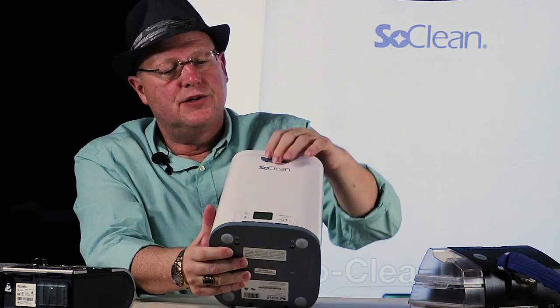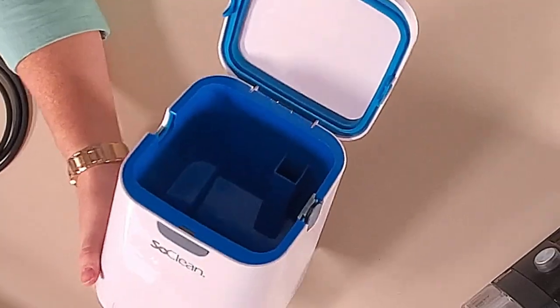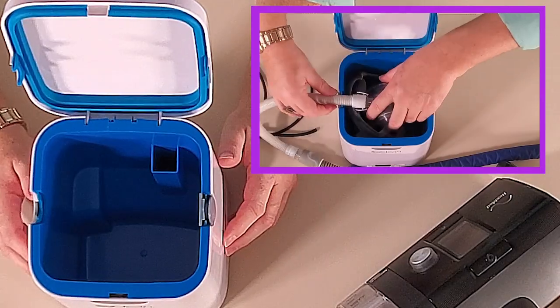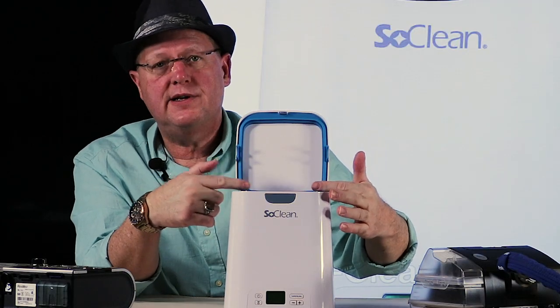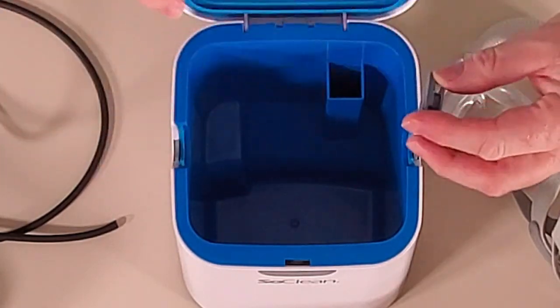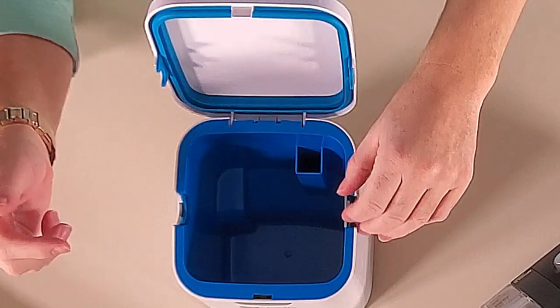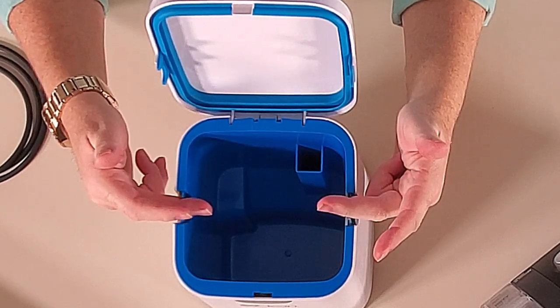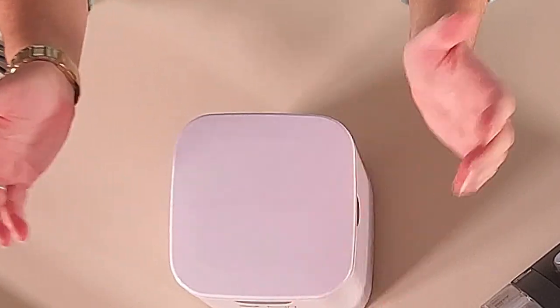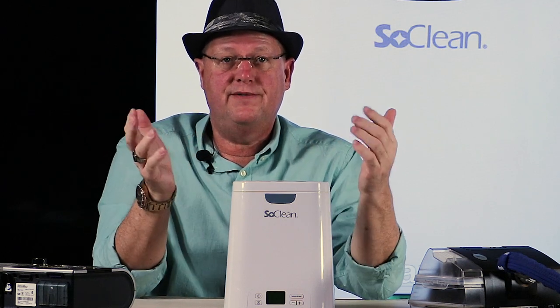You open the lid and inside is the chamber where you put your mask — most people leave the headband attached, and it doesn't hurt to have that disinfected too. The hose can go in on either side depending on placement next to your bed, and whichever side you're not using has a little plug you insert. On each side there is a switch, and both switches must be depressed for the machine to come on. This is handy because if the lid is down with no mask inside, you don't want the machine running and filling your room with ozone.